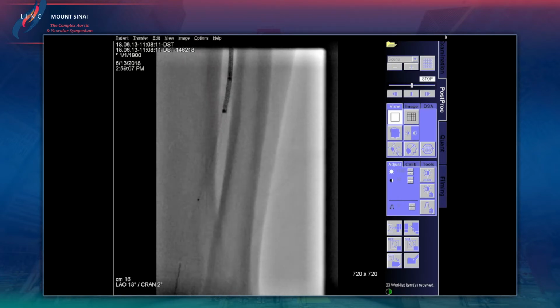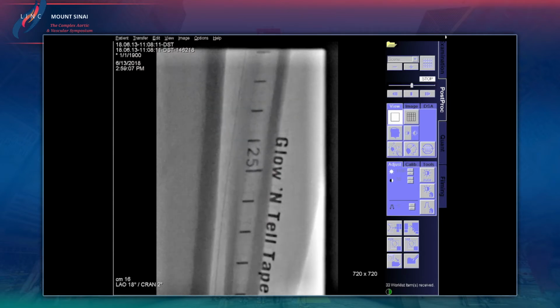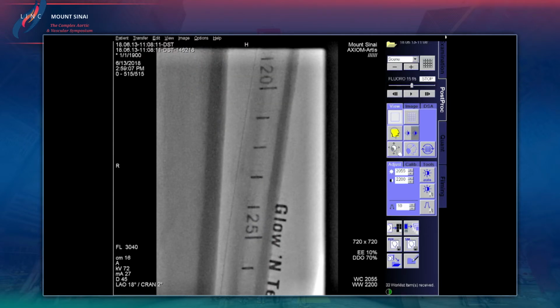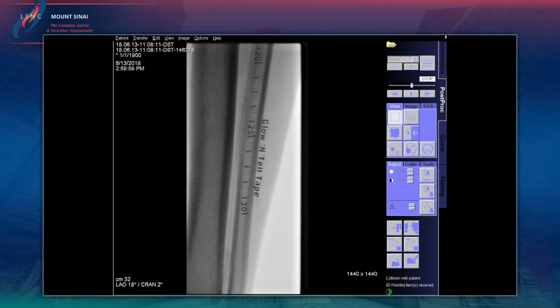So that's the nose cone right there, Brian. So we're able to reach all the way down. We've taken this catheter into the foot, into the DP in the foot, the smaller version of it. Yes. It does work. I mean, you just have to be careful with it. And I haven't had much embolization below the knee. I think above the knee with the volume of plaque, we've had more embolization. So that's been an issue.